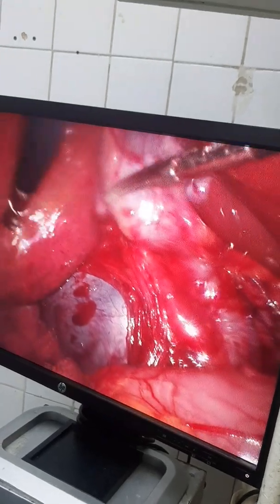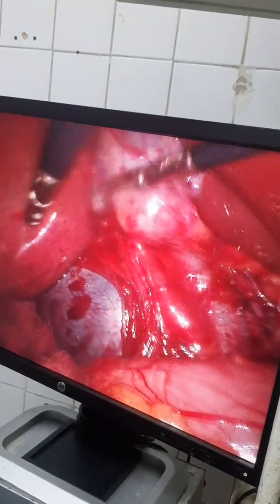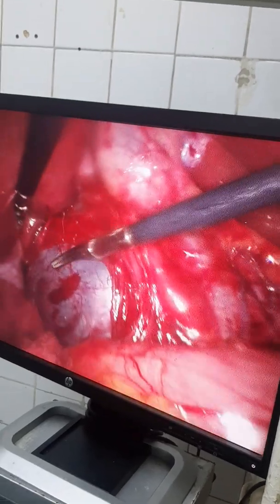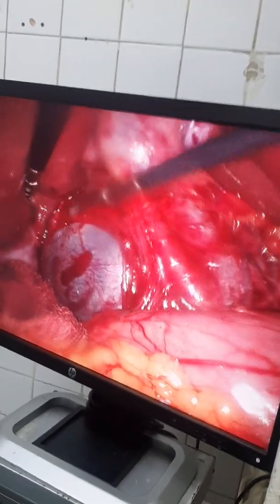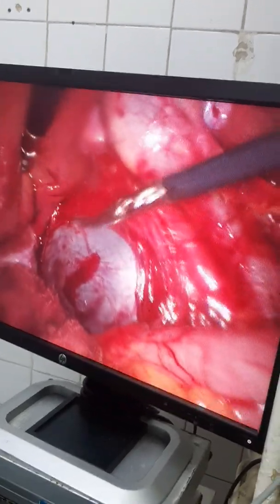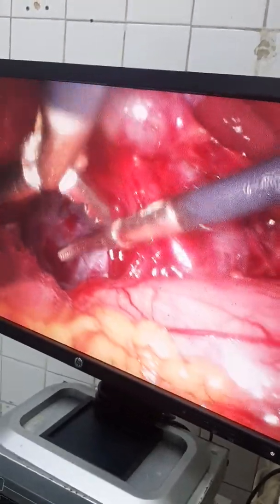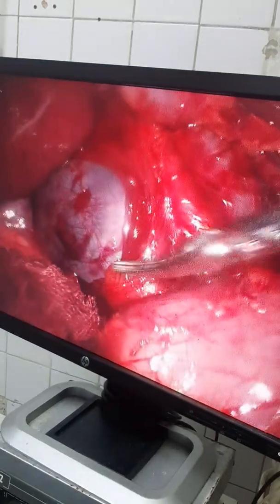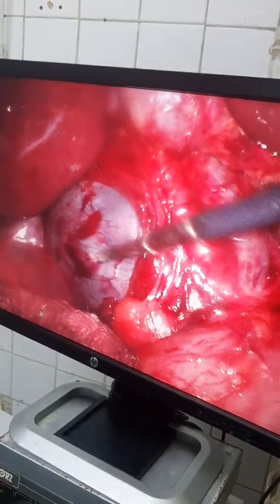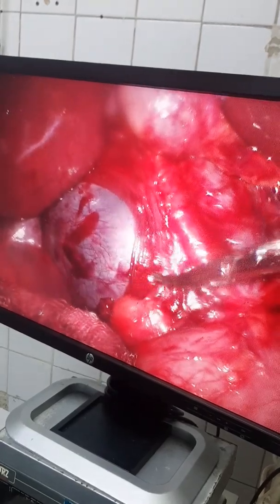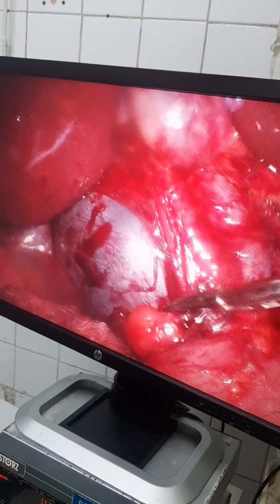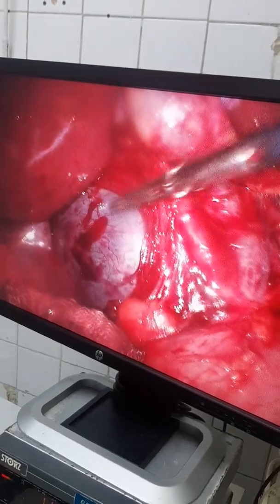This is the gallbladder, this is segment 5. The cyst is in segment 5 and extending into the portal and into the liver. This is the inferior vena cava. We have dissected the cyst here. We will try to do aspiration first to see the nature of the cyst and deal with it if we can.